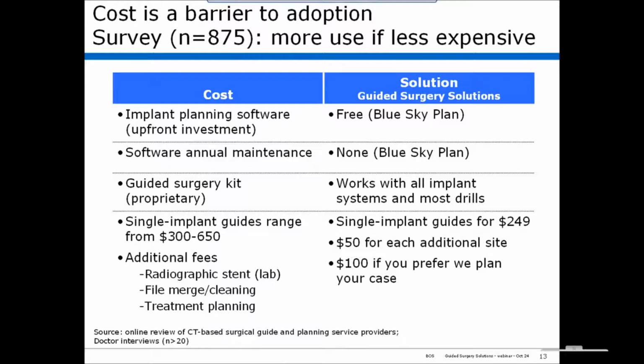The patient would wear that when they were scanned, and then you would send us the model with the little device with the fiducial markers on it, and then we could scan the model with that on it, and we could merge on the basis of the markers. So we've developed a few scanning protocols to deal with these situations.